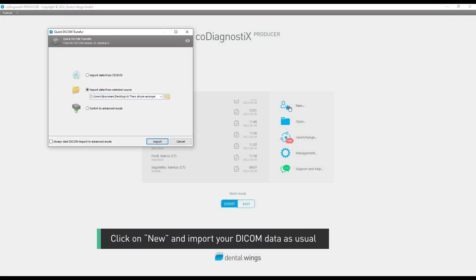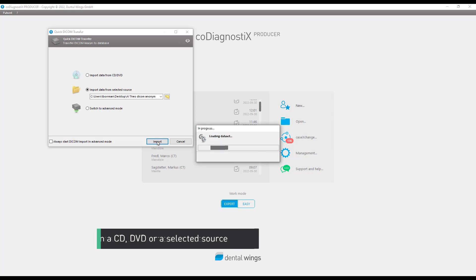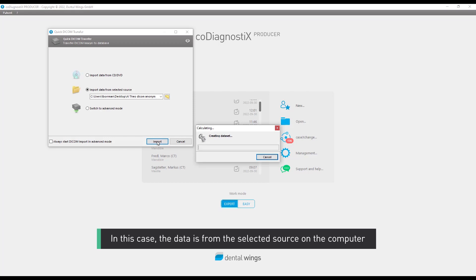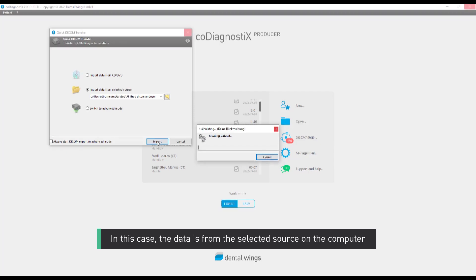Click on New and import your DICOM data as usual, from a CD, DVD, or a selected source. In this case, the data is from the selected source on the computer.